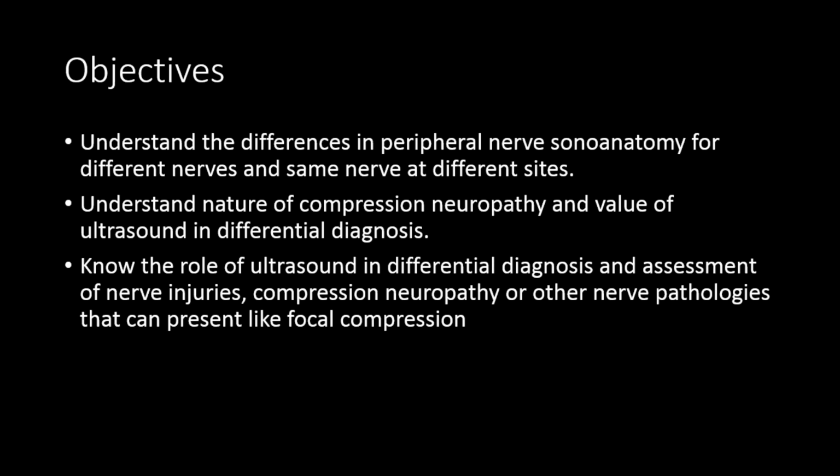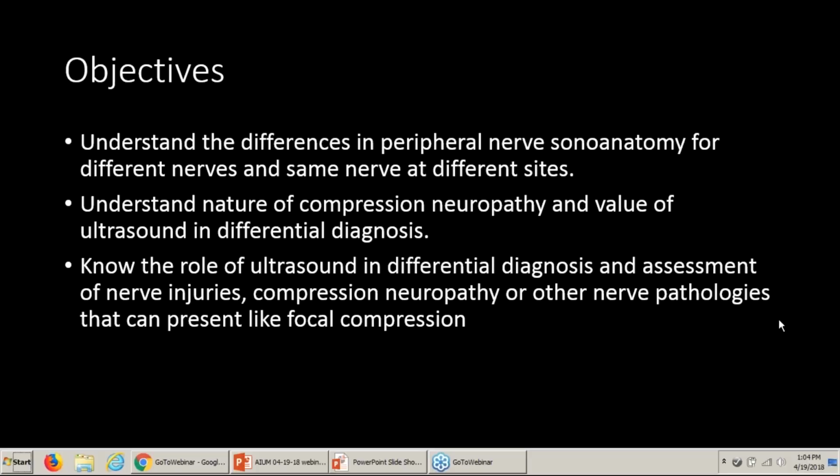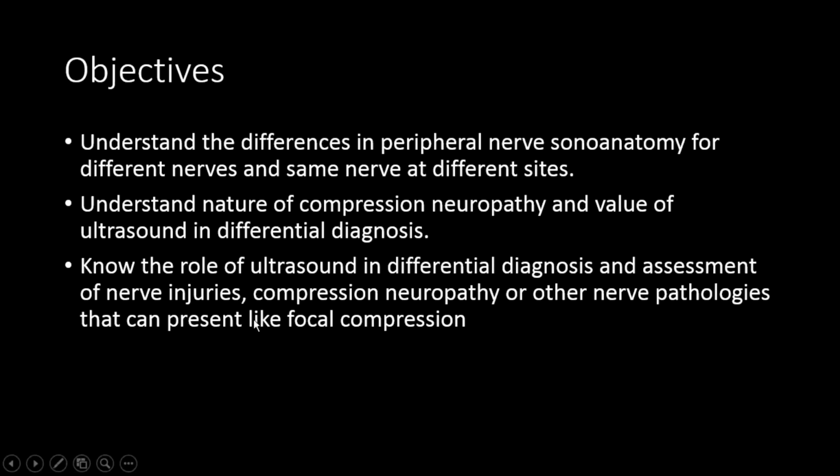We're going to review the physiology of compression neuropathy and scanning techniques of some of the potential regions where a nerve can get entrapped, followed by nerve injuries and traumatic nerve injuries, and the role of ultrasound in assessment and differential diagnosis, and as an important adjunct to your electrodiagnostic studies.